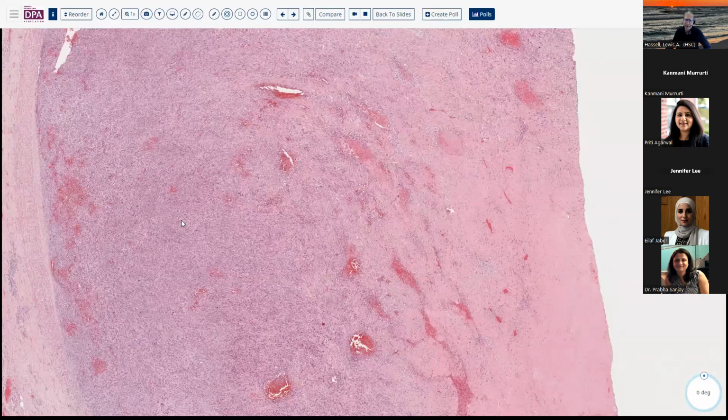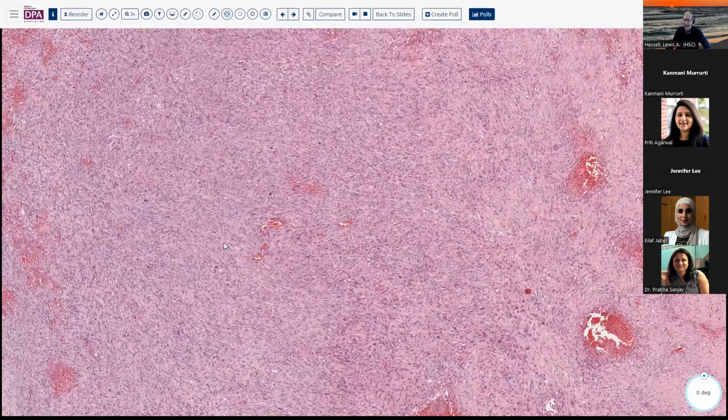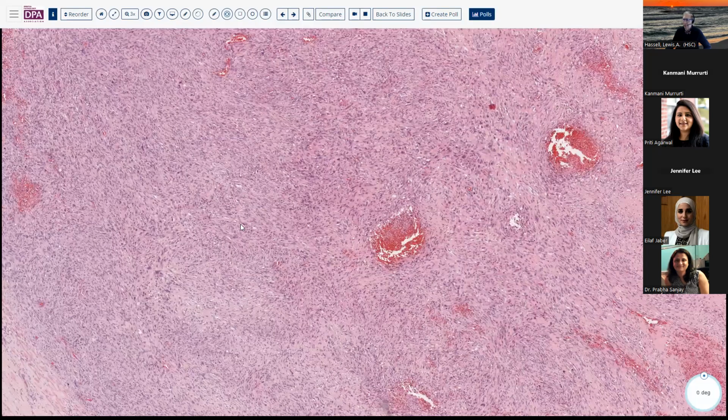In terms of melanocytic markers, I usually also will do S100 and HMB45. PEComas can occasionally be high-grade appearing, somewhat pleomorphic tumors. And so including those melanocytic markers, as well as some myogenic markers like desmin or h-caldesmon, is also very fruitful.